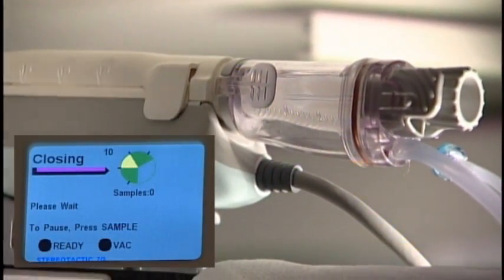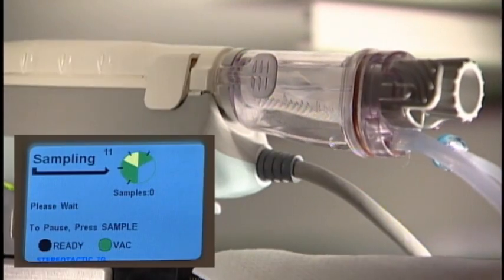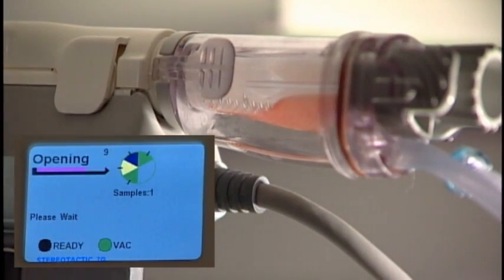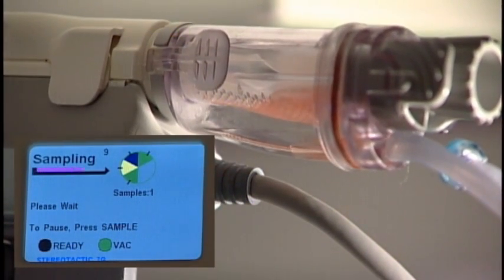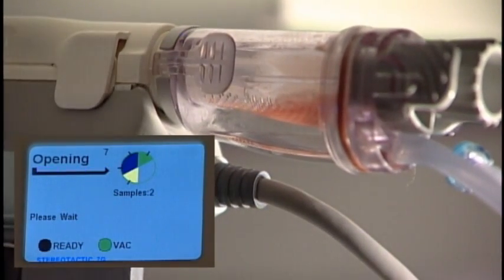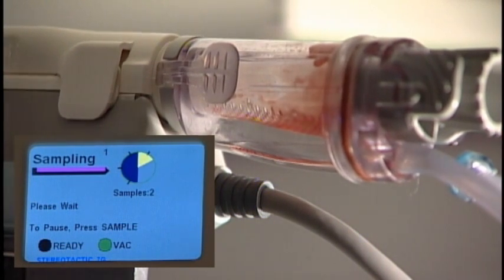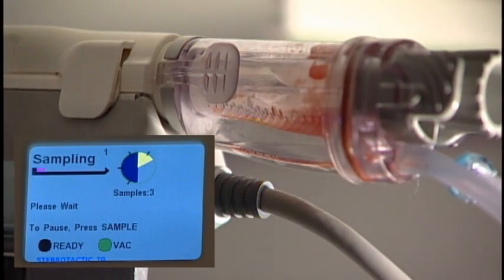This is taking our first sample. We're going to go through the sampling sweep just by keeping our foot on the foot pedal and sampling through the sweep, and then we'll check our tissue samples for calcifications. This is a seven gauge probe so we get a good sample with each sampling.